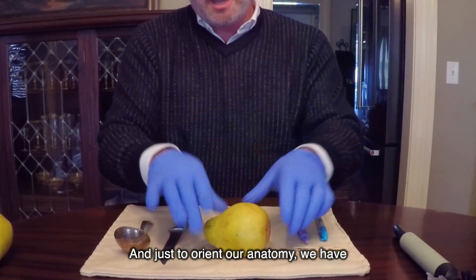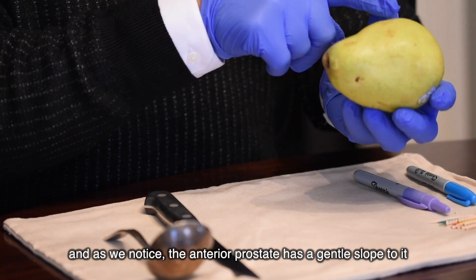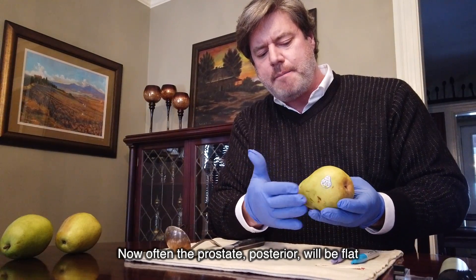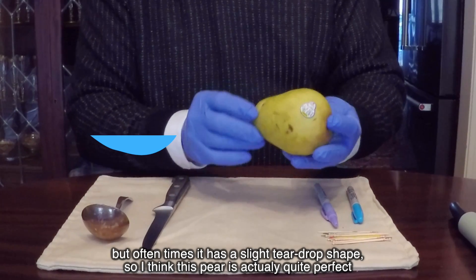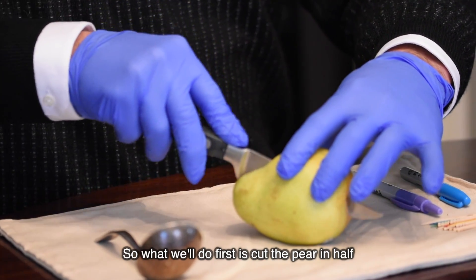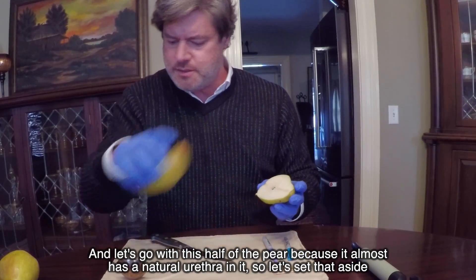To orient our anatomy: the bladder would be here, so here's the base of the prostate and here's the apex. The anterior prostate has a gentle slope to it. The posterior prostate will often be flat but oftentimes has a slight teardrop shape. This pear is actually quite perfect. We'll cut the pear in half.